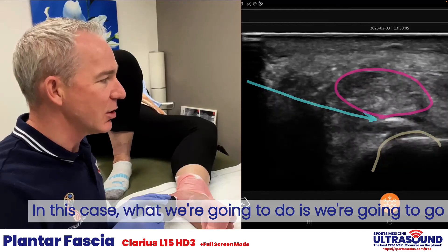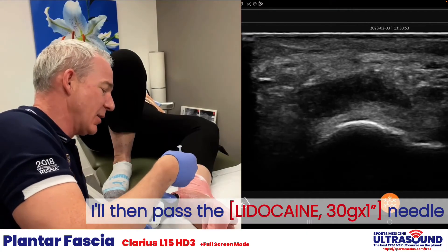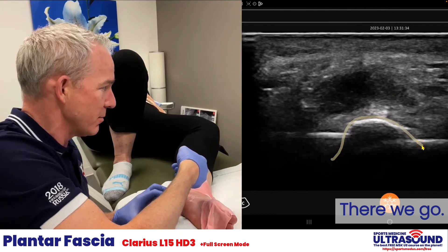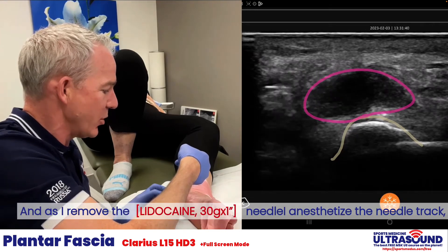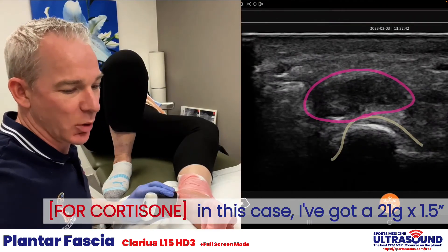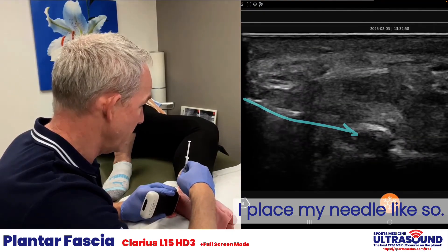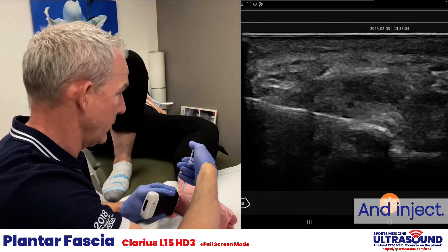In this case, we're going to go to the medial calcaneal tubercle. I'll pass the needle into the target and try to get to that tubercle. There we are. As I remove the needle I anesthetize the needle track. In this case I've got a 21 gauge 1.5 inch needle. Place my needle like so.